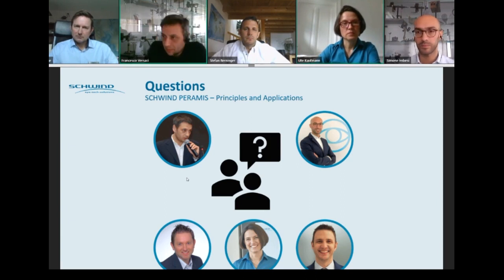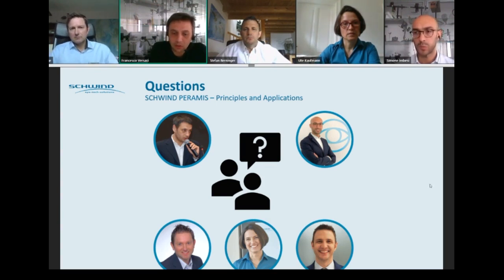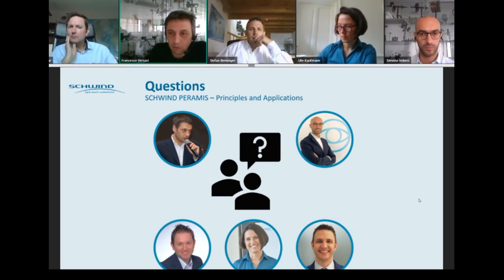Yeah, to talk about what simulation has to be treated, we should introduce the concept of metric of the wavefront, because we have to understand what it means to have a good wavefront or a bad wavefront. Usually, something that is done is to check the quality of the PSF. The PSF is the simulation of how light coming from infinity hits the retina. So if I have a small spot on the retina, the vision will be good. If I have a big spot, I will have a blurred vision.